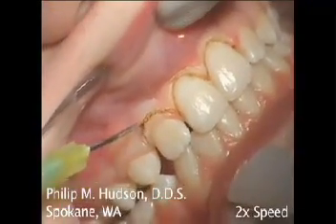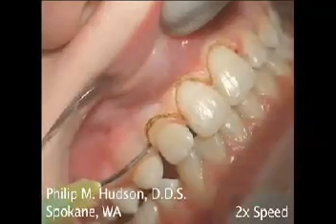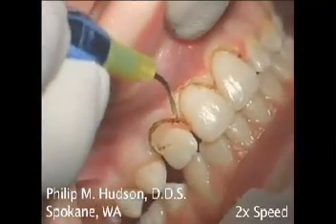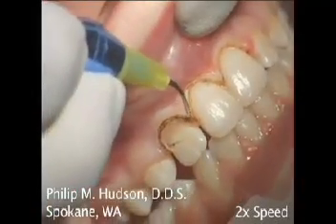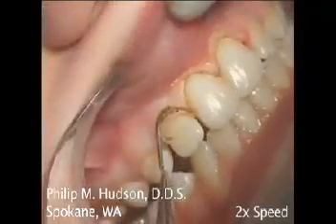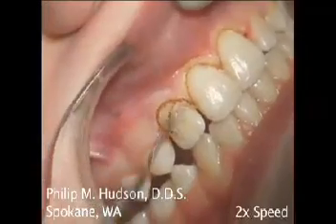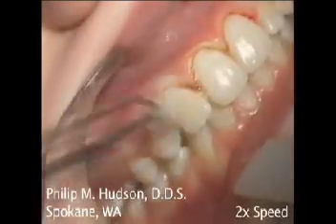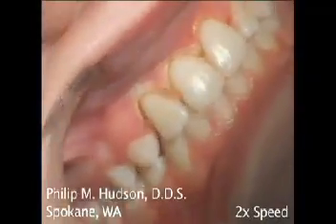Dr. Hudson uses the laser to release the anatomical crowns of the teeth that have heretofore been hidden by excessive gingival tissue. When the laser incision is nearly to the underlying tooth structure, Dr. Hudson prefers to use a periodontal curette to remove the gross amounts of tissue. Dr. Hudson repeats the steps already taken on each tooth to be treated.